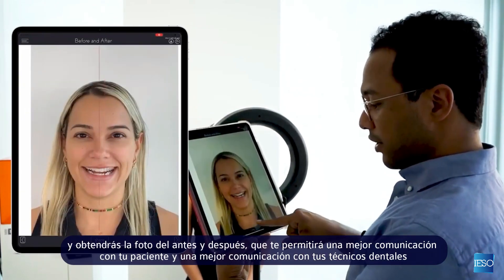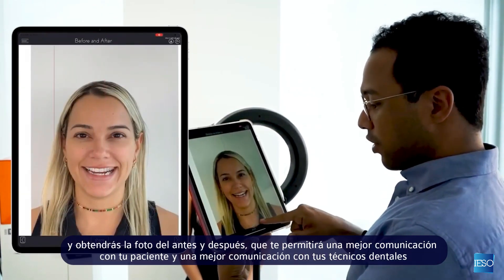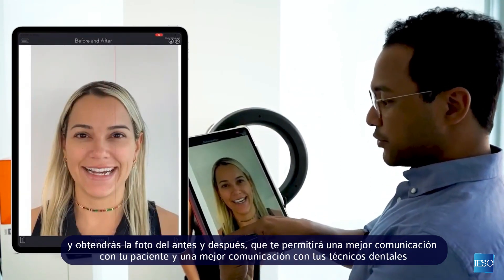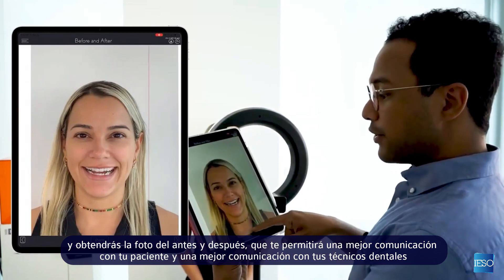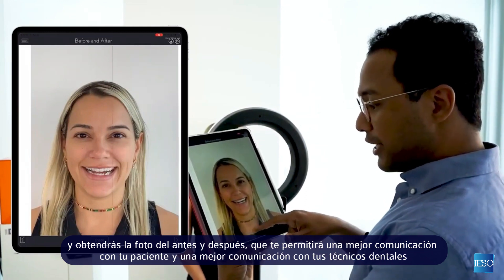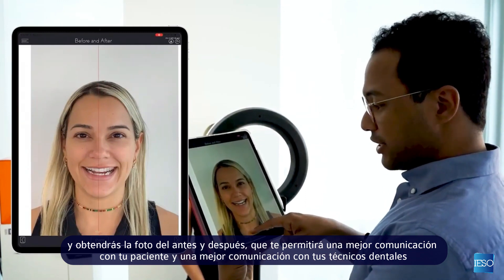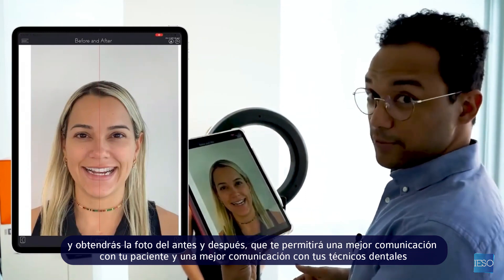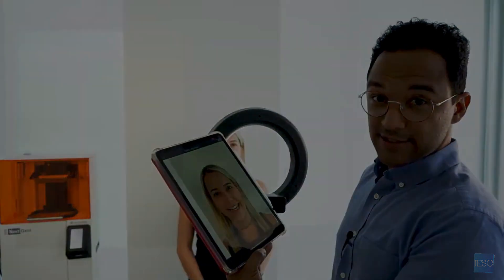You will have your before and after picture, which will allow you to better communicate with your patient and better communicate with the dental technicians.